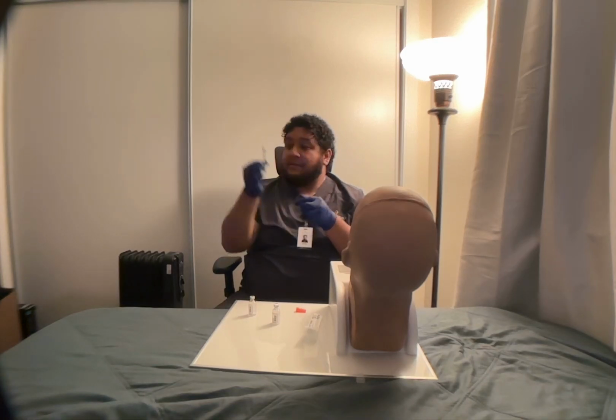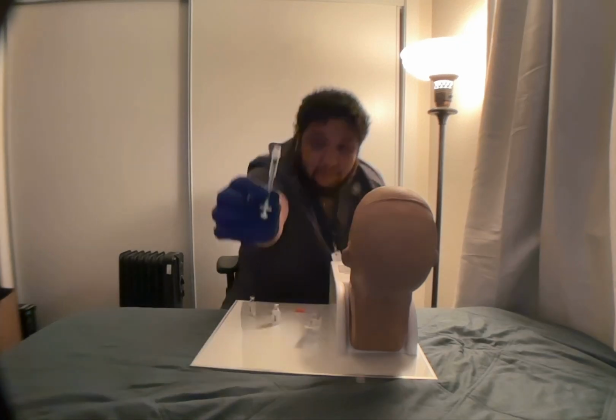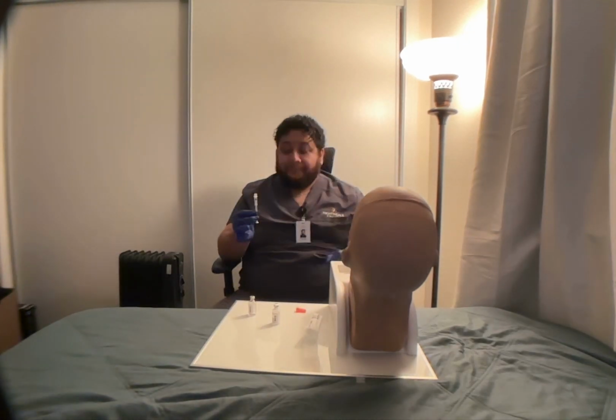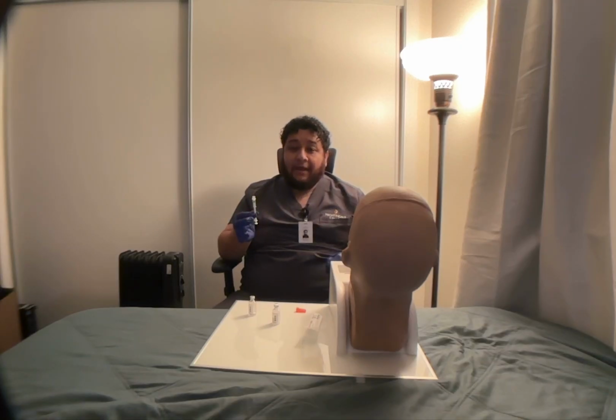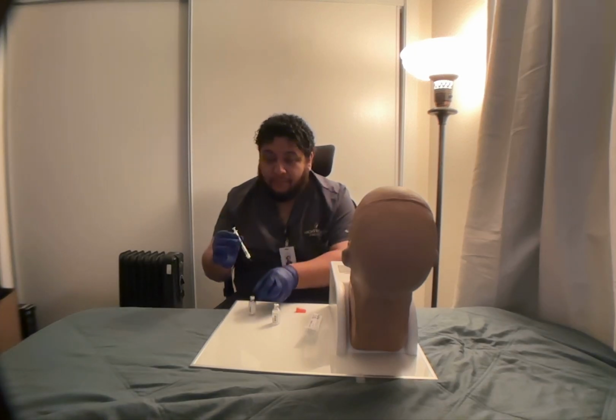Okay, 4 units. Verify with the nurse. Going to verify with the camera. Now I'm going to inject into the regular insulin vial.